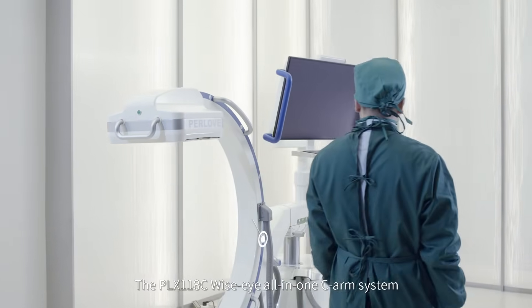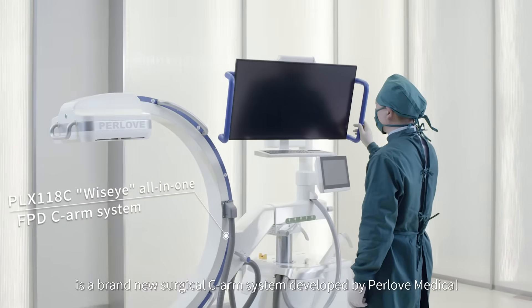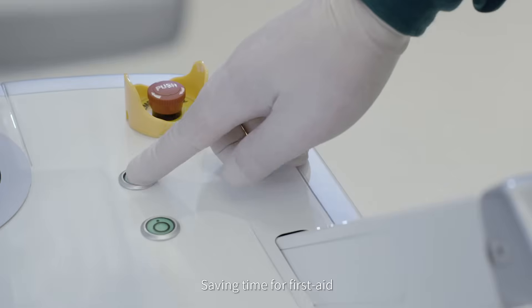The PLX118C WiseEye All-in-One C-Arm System is a brand-new surgical C-Arm System developed by Perlove Medical. Quick start-up design, saving time for first aid.